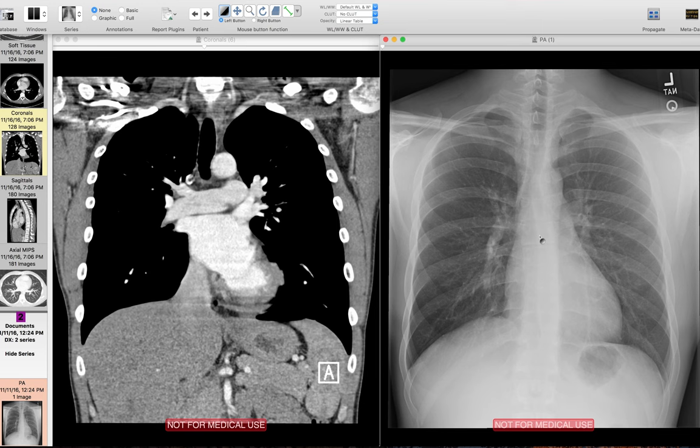One important thing to keep in mind about the structures of the hila is that our rules about the silhouette sign still apply here. The structures that we're able to see in the hila are visible because they're next to other structures of a different density. For this video, I have a normal chest x-ray and a normal corresponding chest CT that we're going to use to help us figure out why the things that we see are visible.